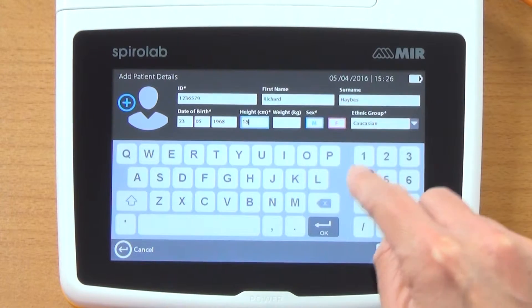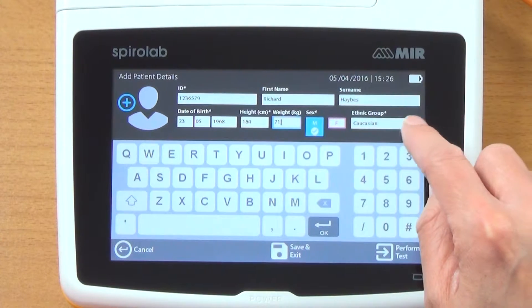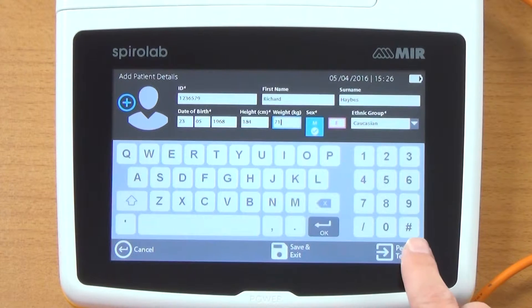Height in centimetres, weight, ethnicity, and male or female. These are the options in here. This is where you could save it, cancel it, or perform a test. So I'm going to perform a test.